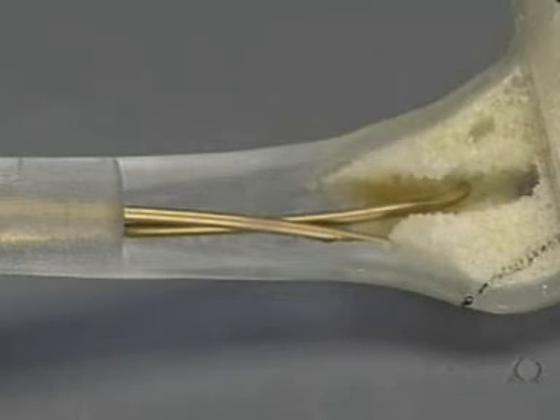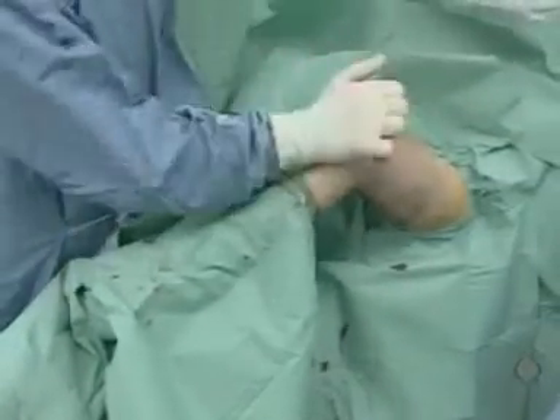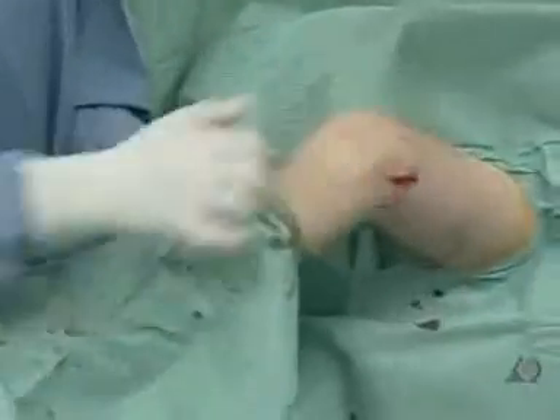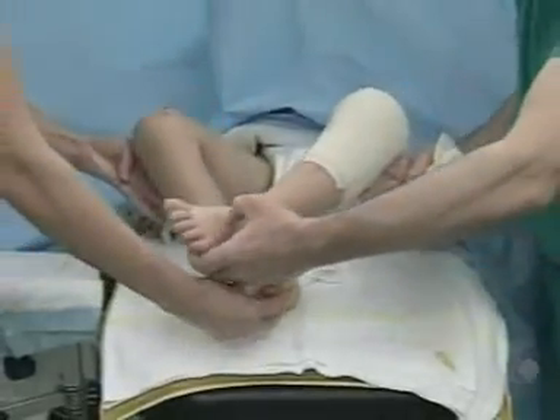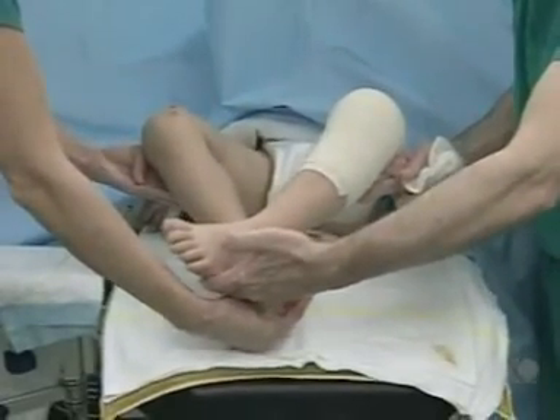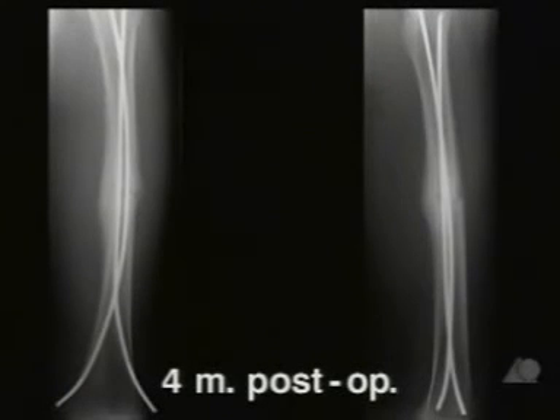Correct anchorage of the nail tips in the metaphysis is essential for perfect stability. It is recommended to check stability by axial blows against the knee and to avoid distractions; the ends of the nails must not become loose. At the end of the operation, rotation must be checked under anesthesia by comparison with the uninjured leg. Post-operative x-rays show anatomical reduction appropriate for a child, with correctly positioned nails and good distal and proximal anchorage. Full load-bearing was achieved six weeks after the operation, and four months post-operatively extensive bone healing is apparent with callus still present.